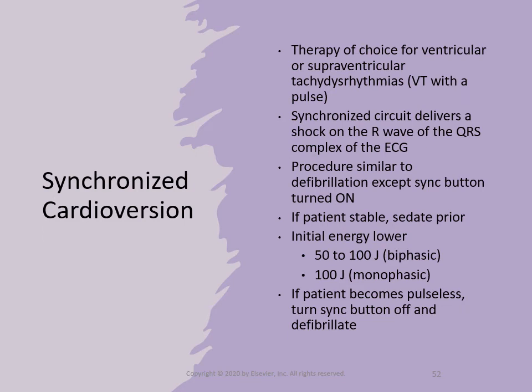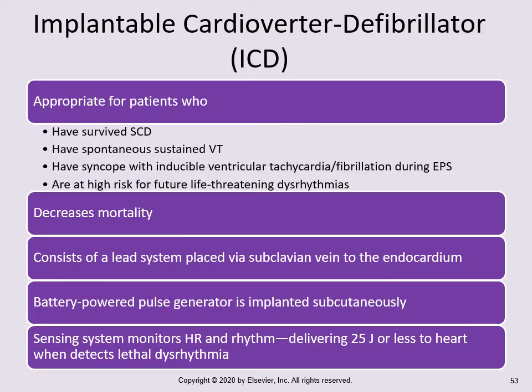The energy levels are lower and the patient will be awake when you do this, so you might want to consider sedation. Patients can go from being a pulsed rhythm to a pulseless rhythm after a synchronized cardioversion, and in that case you would want to immediately defibrillate. You must remember though to turn that sync button off or the energy will not be delivered.